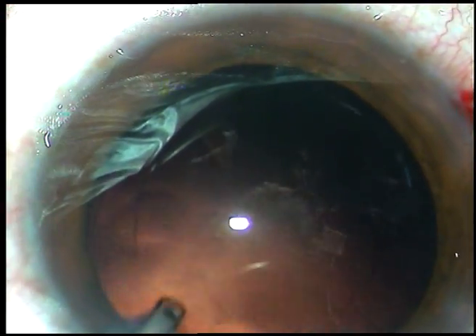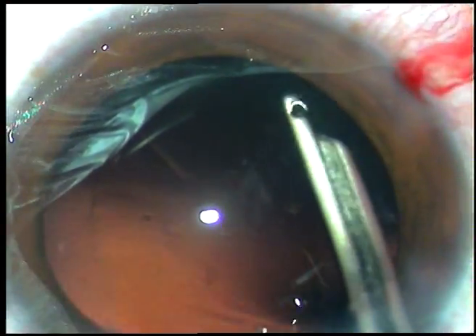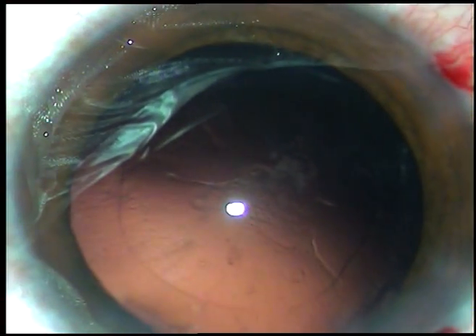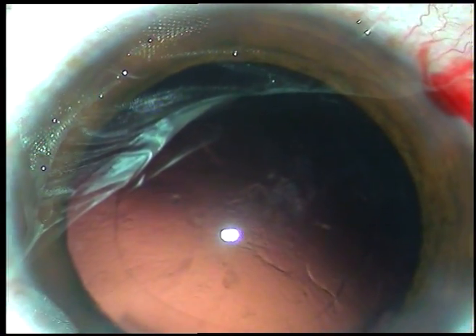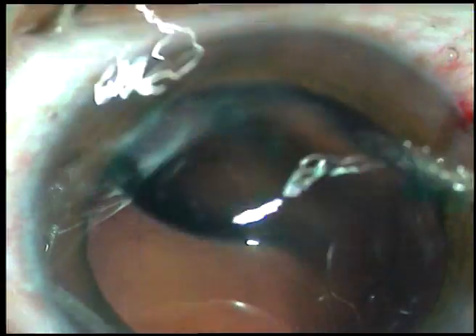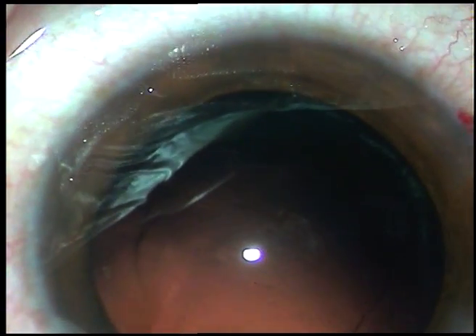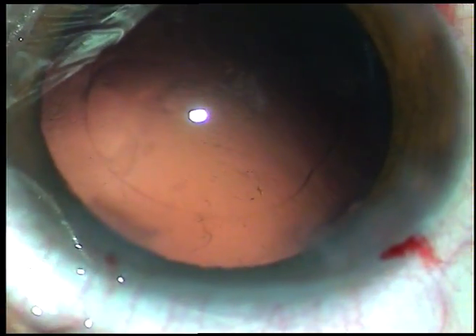In this case, you can see some fibrous tissue sticking to the posterior capsule and it cannot be polished out. The patient is young, 40 years old, and I am expecting the patient will develop PCO very fast. Within three months the patient will need YAG laser capsulotomy. Sometimes I do YAG laser capsulotomy within two weeks if this fibrous plaque causes diminution of vision.